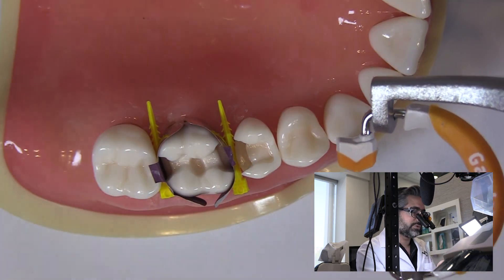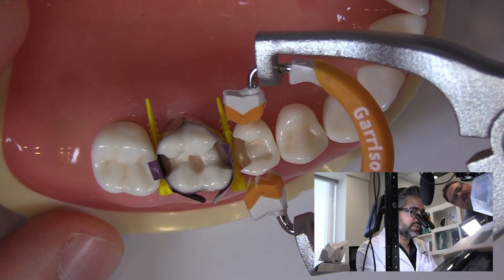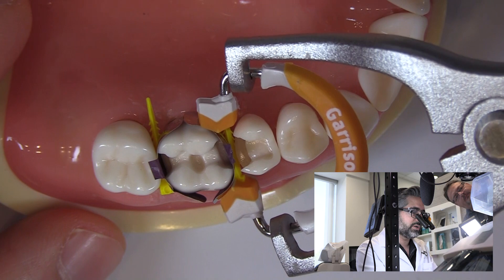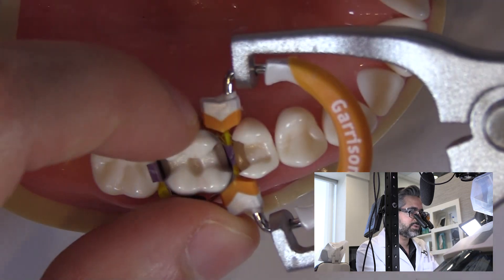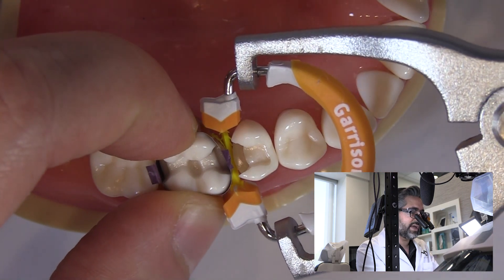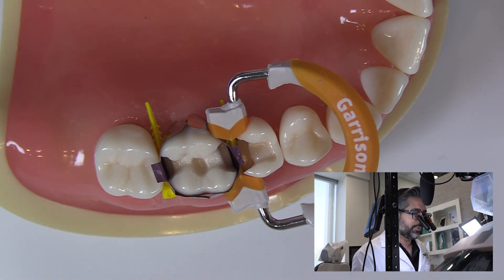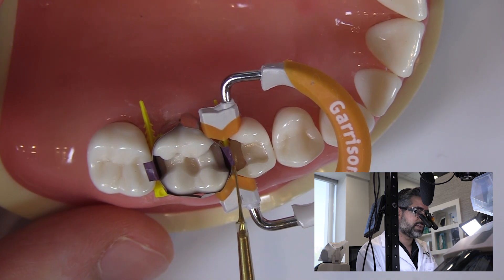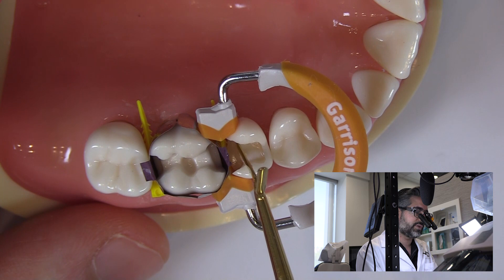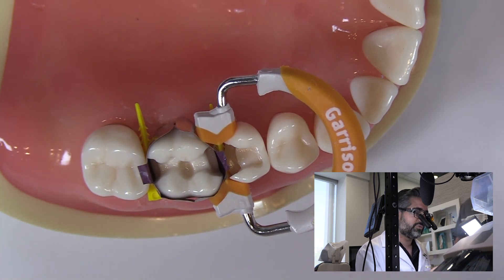Let's say I've built up the distal and I already have my dentin bonding agent down. Now I'm going to move my band to this other side. Same thing — I'm going to come towards it. In this case I'm approaching from the mesial, making sure that if anything happens — see here, it slipped a little bit back and I created a gap. So now I'm going to open again, pinch a little bit, and do the same thing because I don't want to have an overly contoured proximal surface. This is the challenge when you're doing multiple teeth — oftentimes the matrix band is a little over-contoured because there's nothing to stop it. I can pack a little Teflon tape if I need to make it less. Usually I finish this way and then use a soft flex disc with easy contour to polish and contour, and a 12 blade. Then I'll proceed to doing the next tooth.